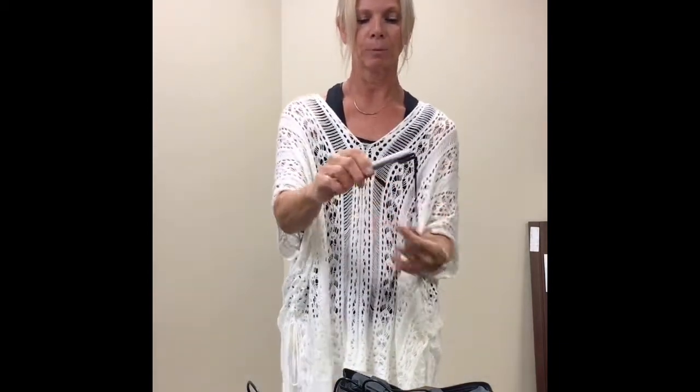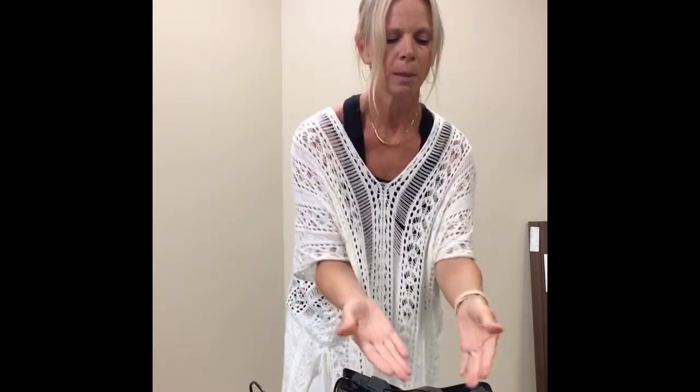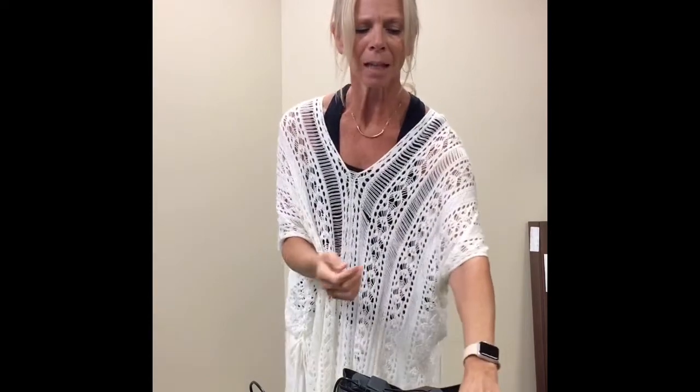Now, this microphone can also be used, and is important for it to be used if the student goes into a small group, if the student is working in a group with other students. This microphone is great to just lay on a table. You can lay it down on a table and it's going to pick up a circle of people. It's also directional.